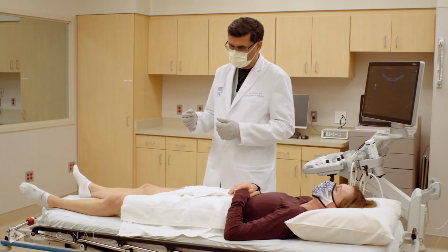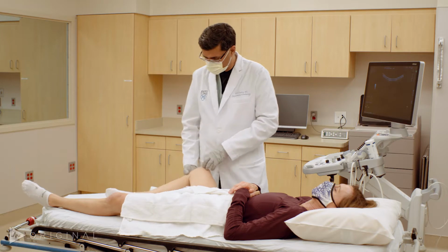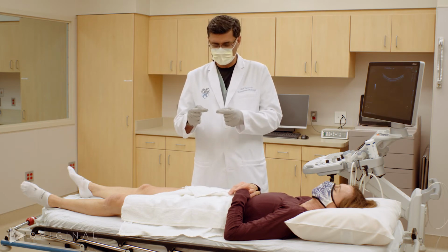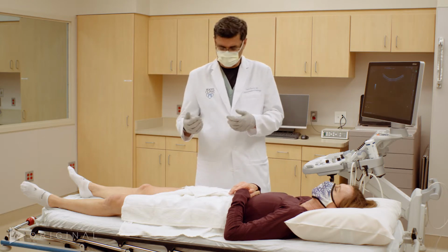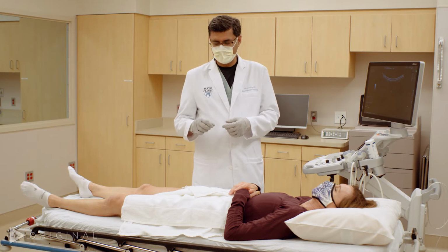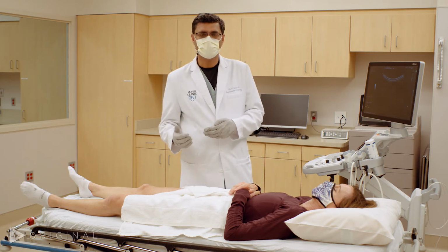To elicit the iliopsoas snapping, what sometimes we do is we will flex the knee joint, externally rotate the limb, and then straighten it. At this point, the interposition of the iliopsoas tendon and the iliacus muscle makes the sound which patients will come and say, I feel a snap in my hip. So while we do that, it is important that the transducer is in transverse orientation on the psoas tendon. It can be very difficult to do that. It takes some practice, and you might have to do it many times before you can make a good judgment of whether there is a snap or no snap.